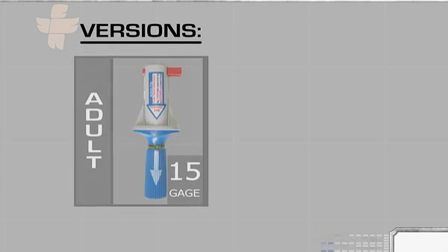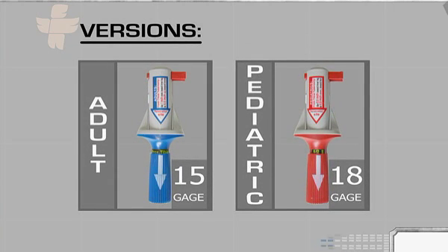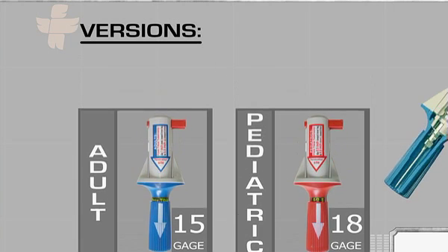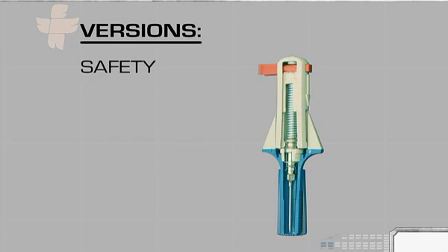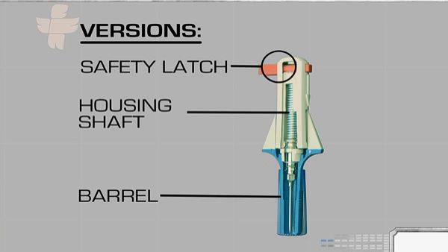There are two versions of the device: a blue adult unit with a 15-gauge needle, and a red pediatric unit with an 18-gauge needle. Regardless of the needle's gauge, both devices have the same basic components: a red safety latch, a shaft that houses the spring, piston, and needle, a red or blue barrel with directional arrow for correct deployment, and safety wings to ensure proper handling.